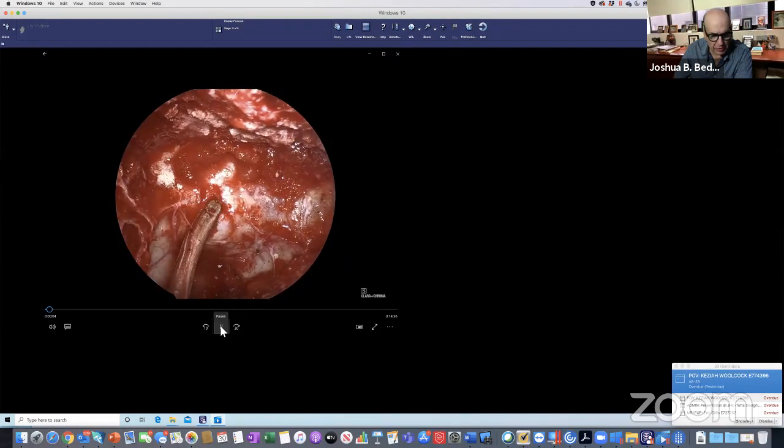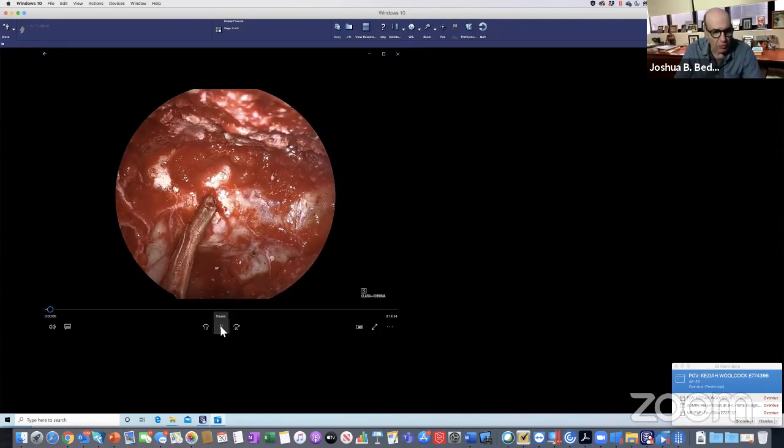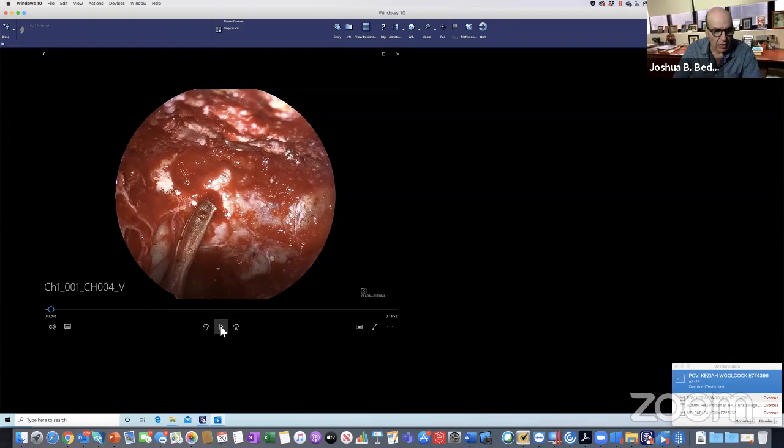This is frequently what we see when we come into the room these days with our amazing colleagues in ENT. This is often the exposure I will see. By this time, they've maybe removed the turbinate if there's going to be a nasal septal flap, and we're doing a bilateral approach. They've opened up the anterior sphenoid. They've removed the sphenoid. So this is the anatomy we see.